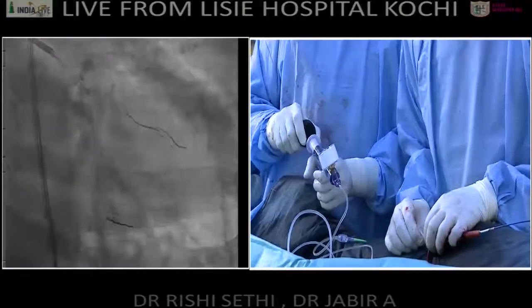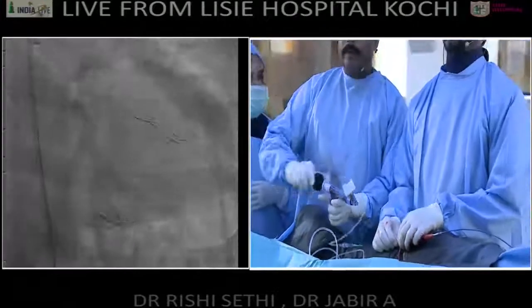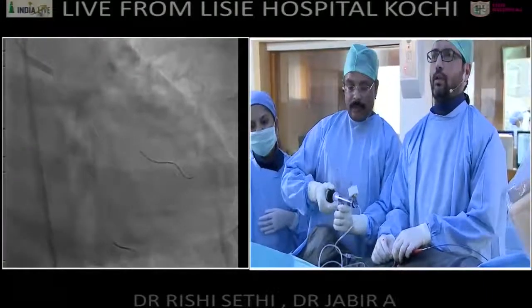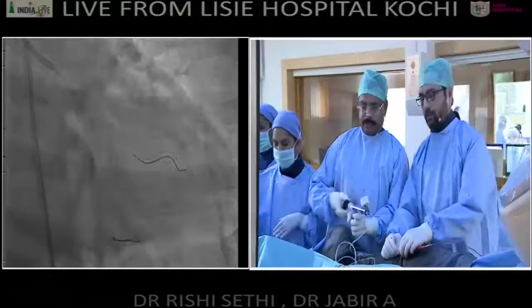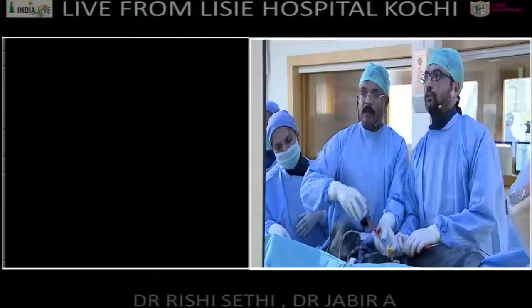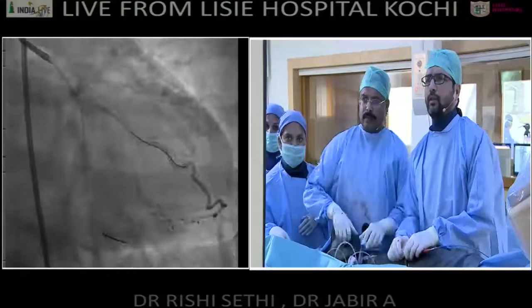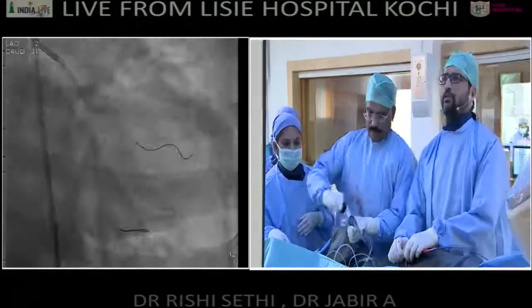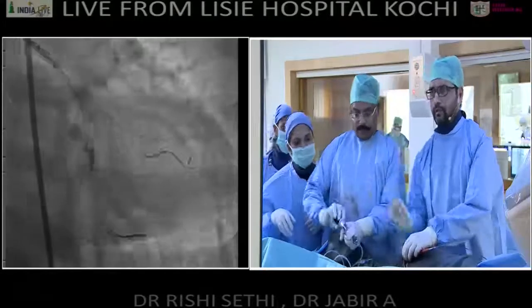Can I give you a test, please? A little bit. I think you're okay. Oh, it's okay. I'm going up. Okay. How much is it? 14, 16. Down, please. Check. Okay. A little bit forward. Go again, please. Again, please. Okay. Not too dilated. 12. 14, 16. That's okay. Down, please.